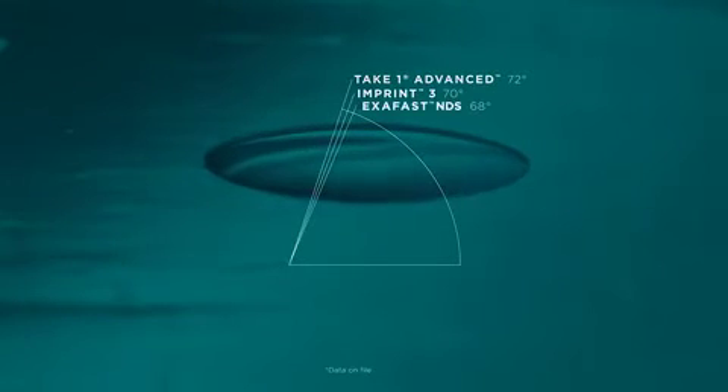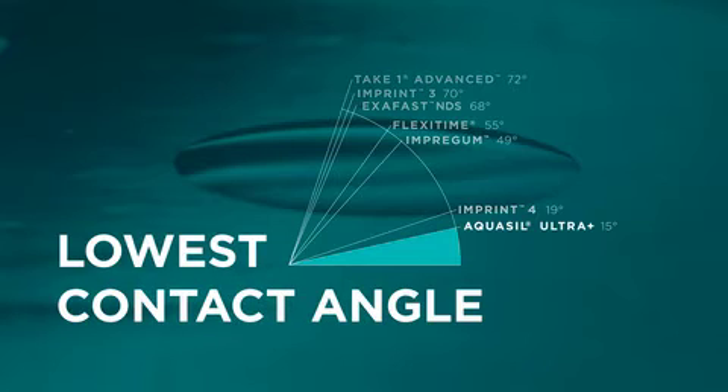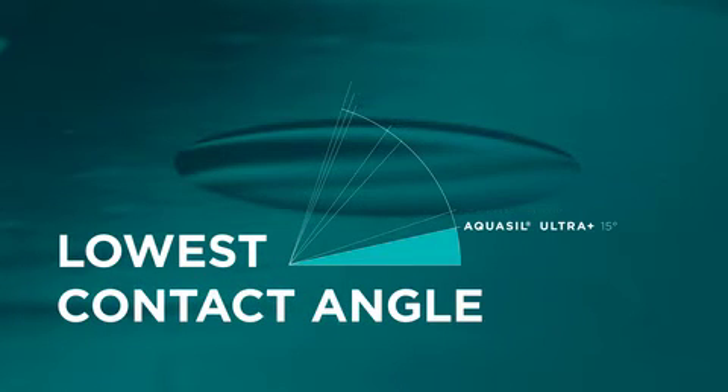In fact, Aquasil Ultra Plus impression material has the lowest contact angle on the market for both cured and uncured material. There is no better impression material for intra-oral hydrophilicity.